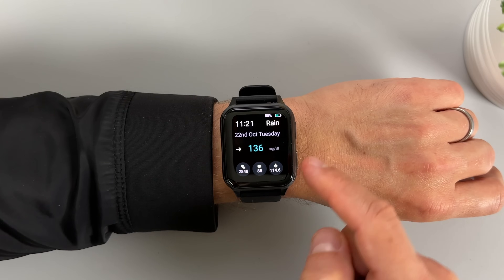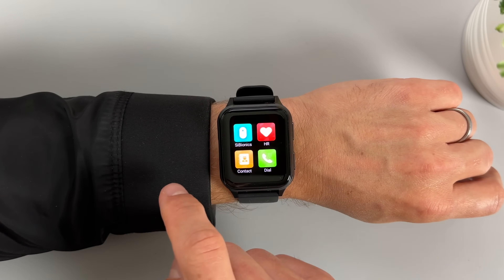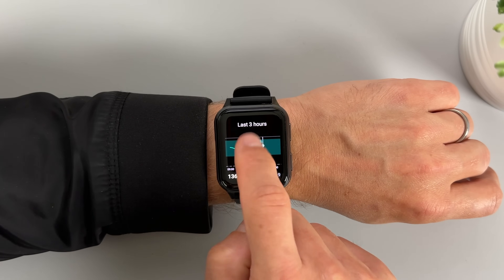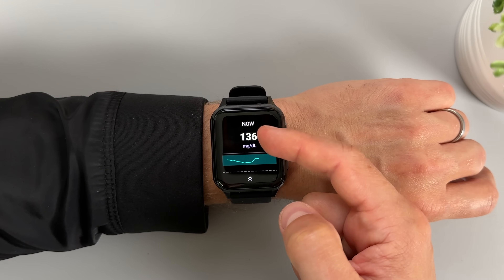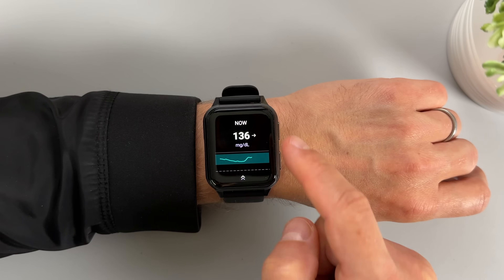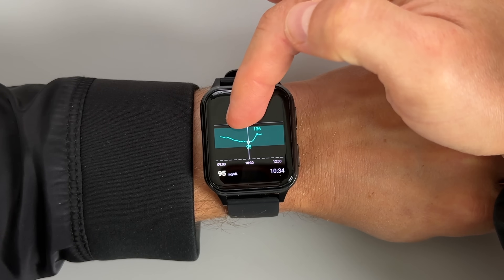No smartphone needed. And here you can see how the watch app looks. You can view your glucose information on the watch face or in the dedicated Cybionics app, in millimole per liter or in milligrams per deciliter. The app shows your current glucose readings, an arrow to indicate where your glucose is trending, and a glucose graph where you can see what your glucose has been over the past few hours.